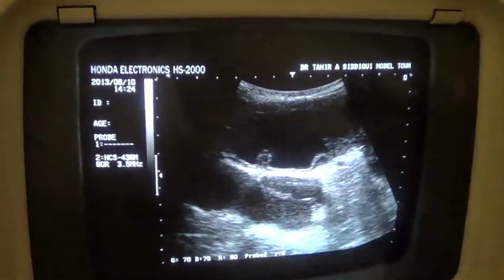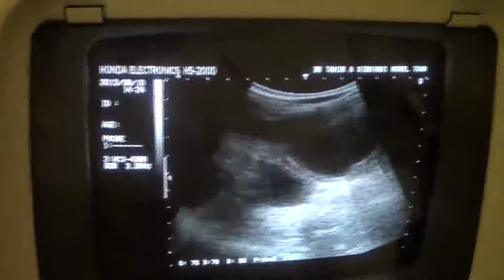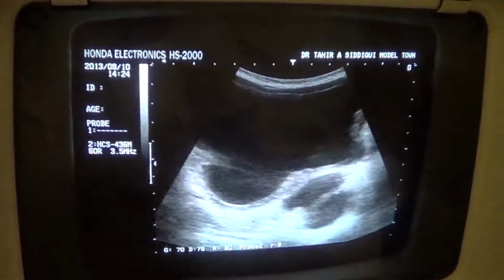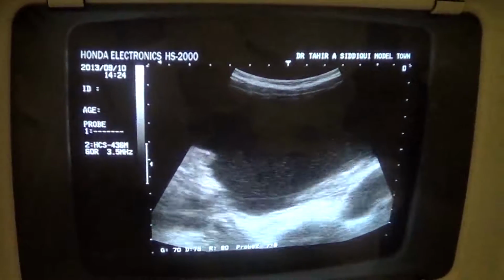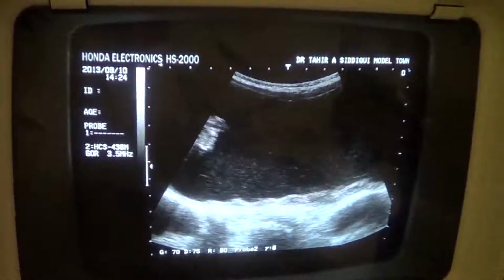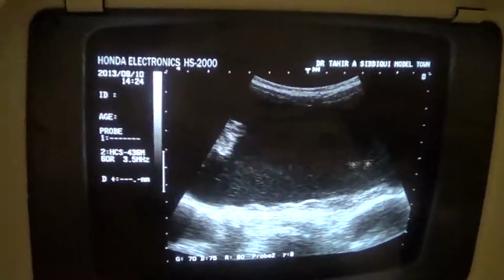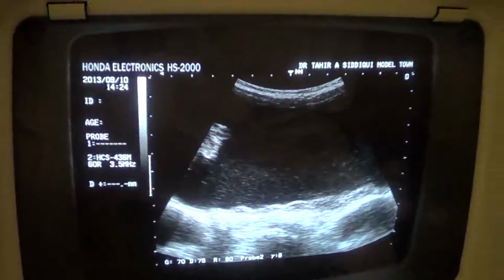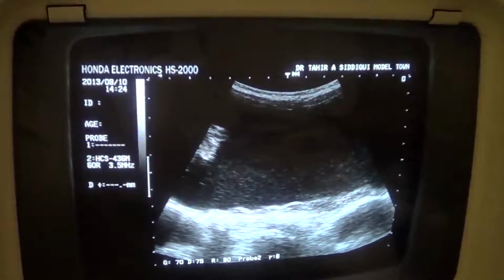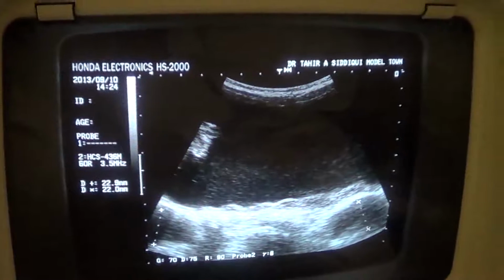This is the distal ureter, which is full of echoes, left-sided, and this is the distal ureter on the right side, as you can see here. You see this dilated cystic structure with a dependent region, floating low-level echoes, no calcification, no septa, no solid element. This is the dilated right distal ureter. This is the dilated left ureter.